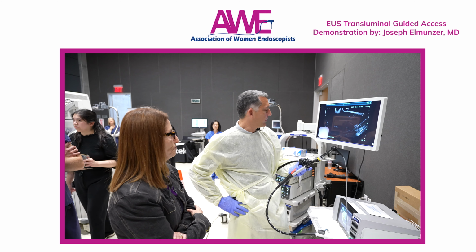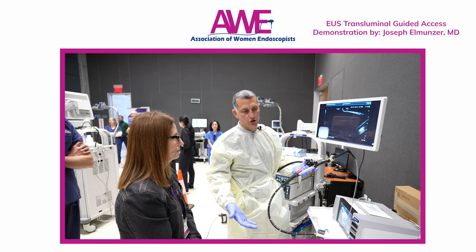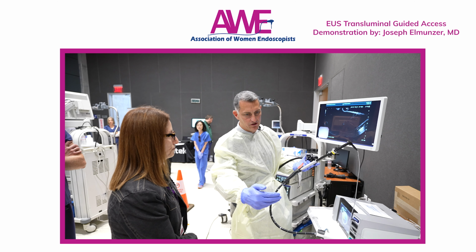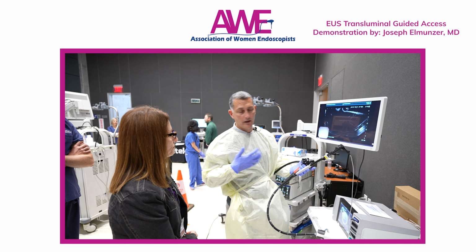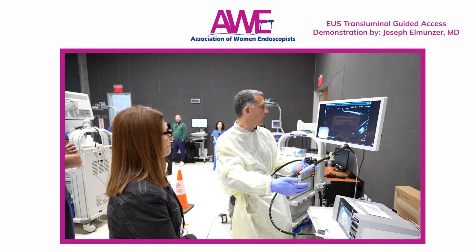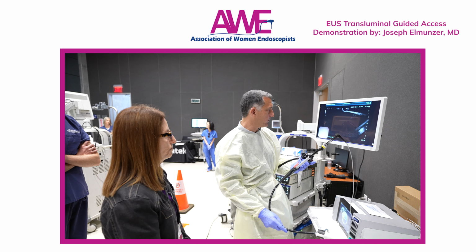Typically, the first thing to ensure is that you're in the most optimal position and that your target is large enough to accommodate the deployment process of the stent. During deployment, the leading edge, what's called the nose cone, is going to move forward and potentially push you backwards. You want to make sure that's not going to push you out of your target structure. Part of that is making sure you have enough working space on the other side, but part of it is ensuring that you are stable enough and you're not easily going to fall back. So that's the first step: you want to be relatively stable.